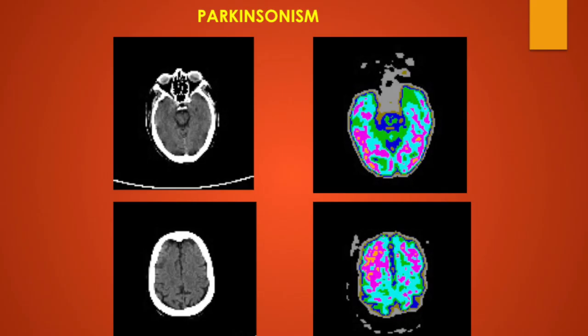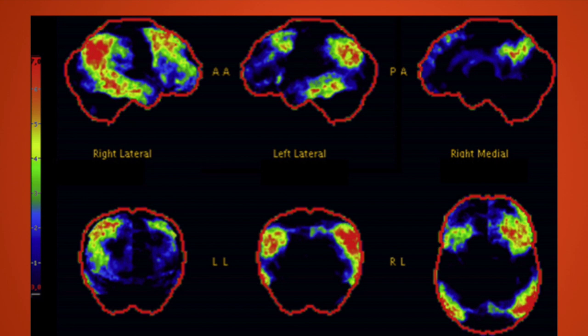Coming to Parkinsonism, you see Parkinson's dementia — there is hypometabolism in the parietal and temporal lateral cortices, similar to the pattern in Alzheimer's disease. But the important distinction is preserved glucose uptake in the basal ganglia. This is another case showing diffuse functional evaluation of the brain parenchyma, with multiple areas of orange and yellow followed by blue areas. All blue areas seen in bilateral regions are the hypometabolic regions, while the orange and yellow areas represent normal cortex with normal metabolism — that is how you identify hypometabolism in the frontal lobes of the cerebral parenchyma.